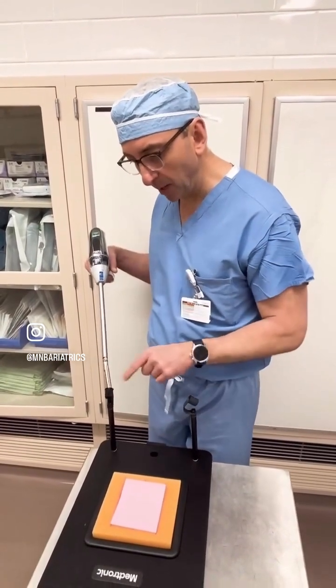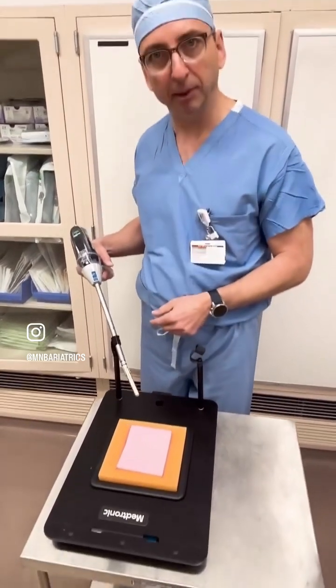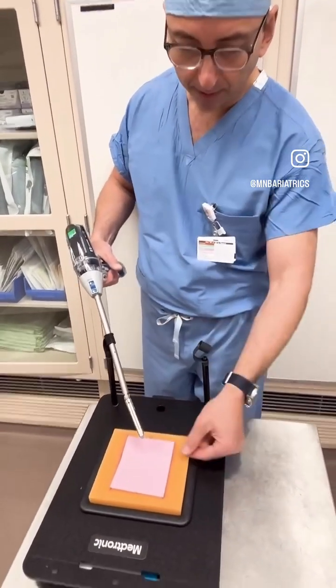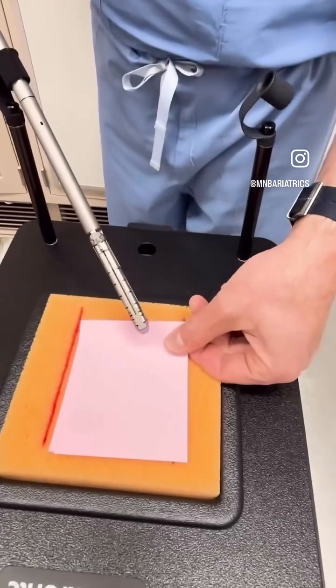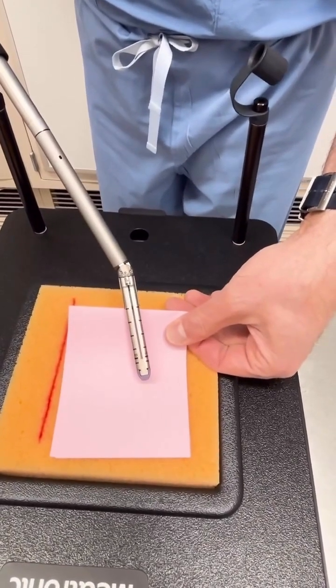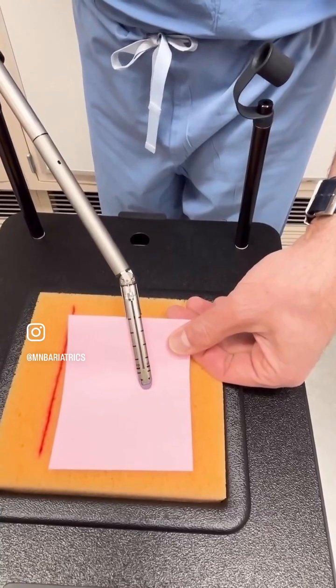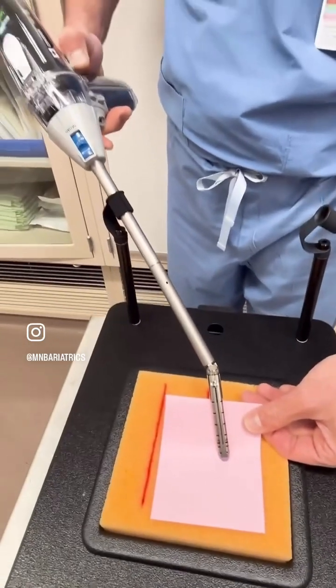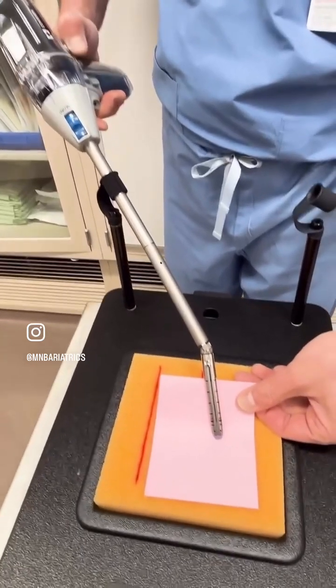We'll pretend this is the body. We introduce the stapler into the abdominal cavity through the trocar and we open it. This is — let's say — this is the stomach that we want to staple. We articulate the stapler, place it where it needs to be, clamp it down. There is a safety feature here, the green light, which I am going to push, otherwise it will not let me fire it.